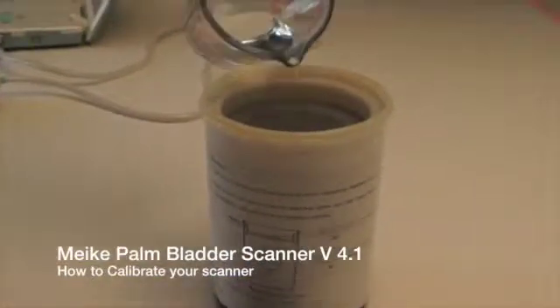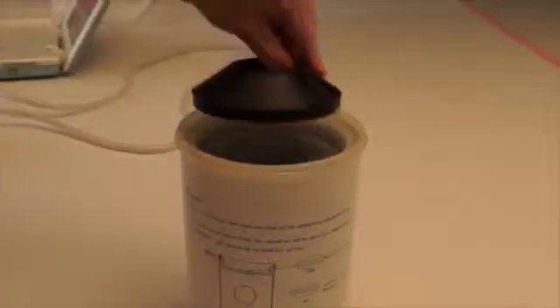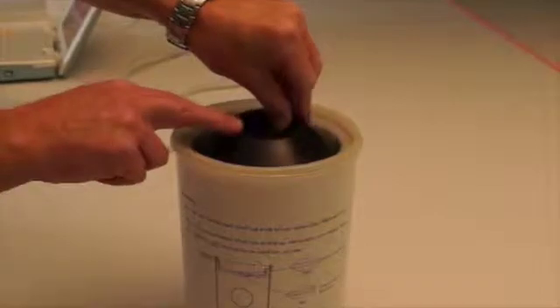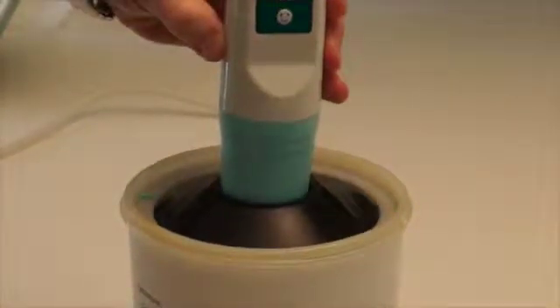We're going to use a Palm Phantom Bladder. This is a purpose-made plastic container filled with thick viscous liquid which contains a sphere of 160 millilitres size. We're going to use some water in the top, about 100 millilitres, to set the unit up and then place the probe vertically in the top.